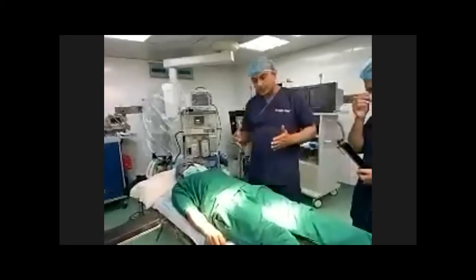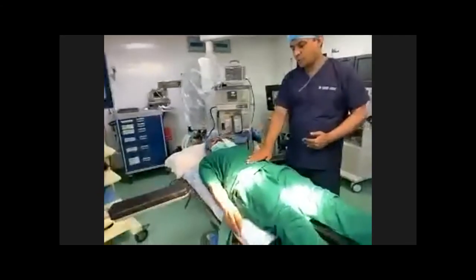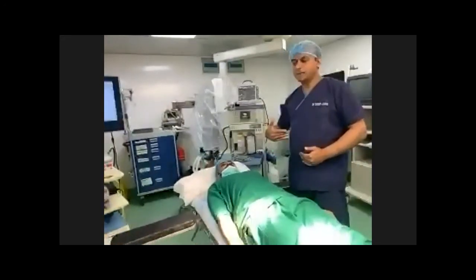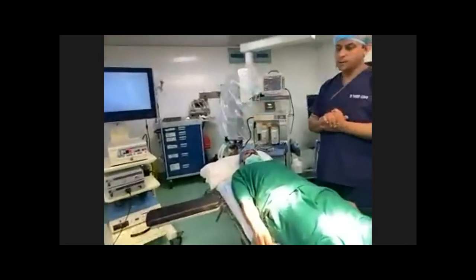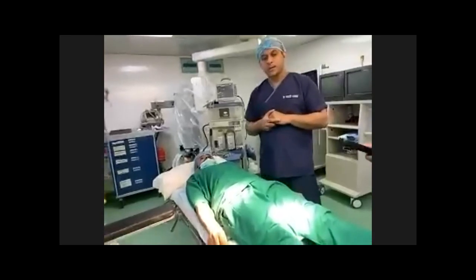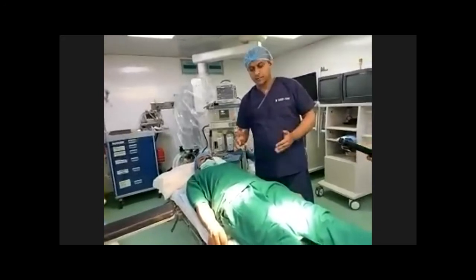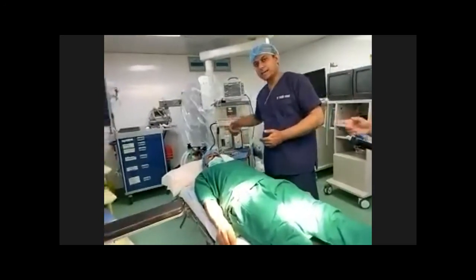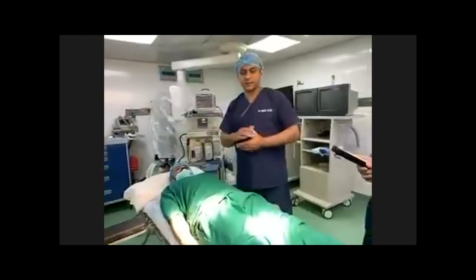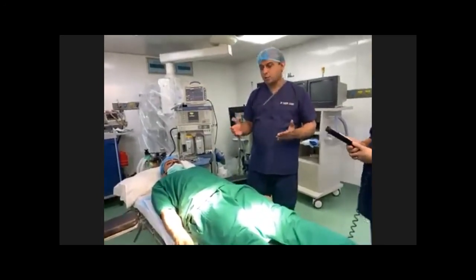While you are performing laparoscopic appendicectomy, usually the surgeon stands on the left of the patient. You put in the ports, and the cameraman stands on the right of the surgeon holding the camera, and one assistant or the scrub nurse stands on the opposite side of the patient. And if you are performing a laparoscopic hysterectomy or ovarian cystectomy, the surgeon stands on the left side of the patient and puts the port in. The cameraman stands on the right of the surgeon, and the assistant stands on the right side of the patient. So these are a few important procedures which you perform every day, so you should know them.